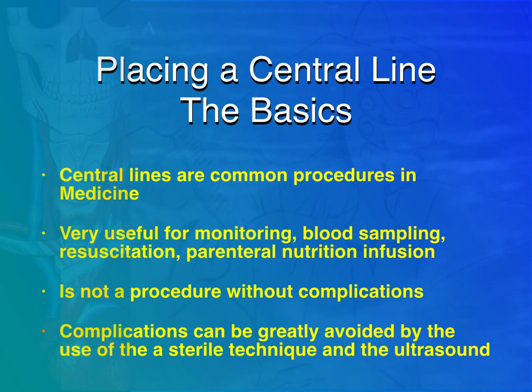So central lines are common procedures in medicine, very useful for monitoring, blood sampling, resuscitation, parenteral nutrition infusion. It's not a procedure without complications, very important. Complications can be greatly avoided by the use of a sterile technique and the ultrasound.